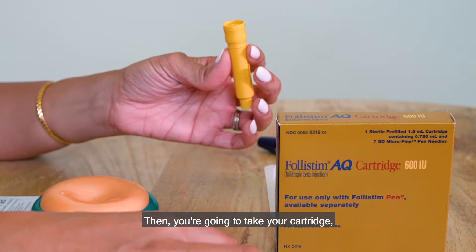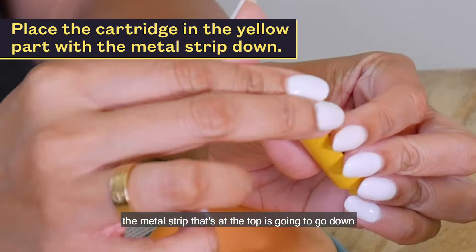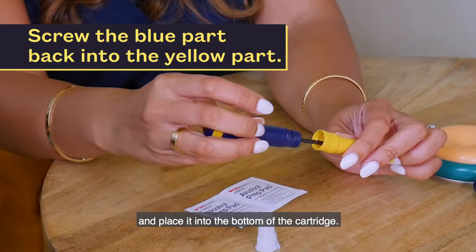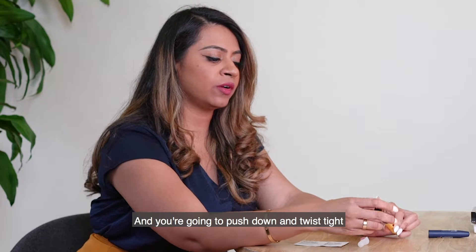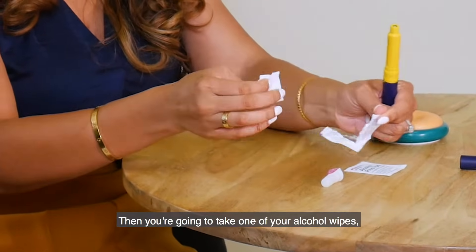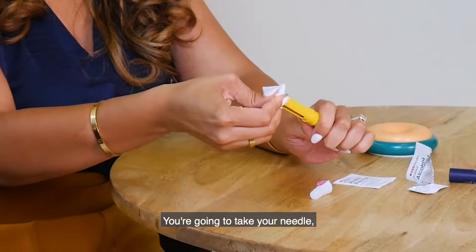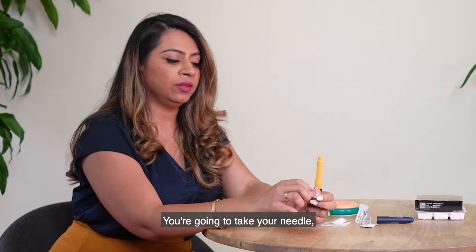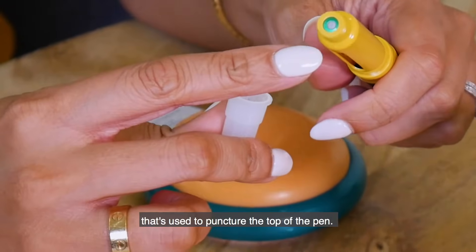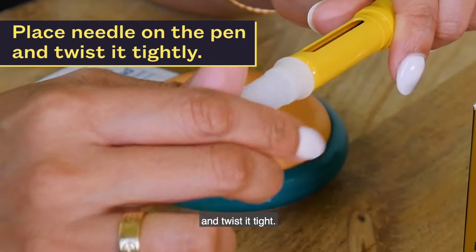Take your cartridge — the metal strip at the top is going to go down towards the bottom of this part of the pen. Then take your spring and place it into the bottom of the cartridge, push down and twist tight until both shapes match up. Take one of your alcohol wipes and clean off the top of the pen. Take your needle, pull off the tab — be careful because there is a needle on the inside used to puncture the top of the pen — and place the needle on the pen and twist it tight.